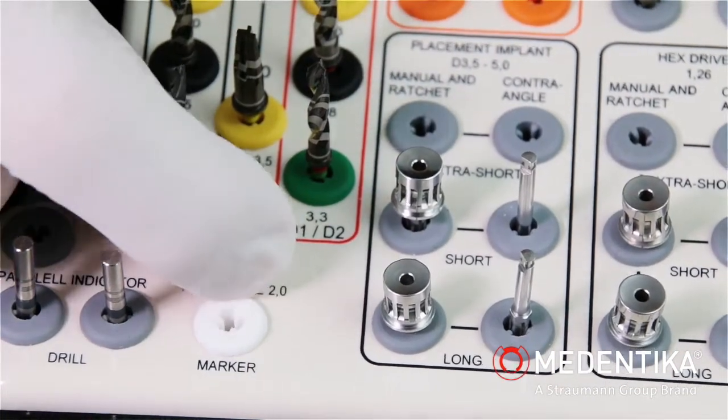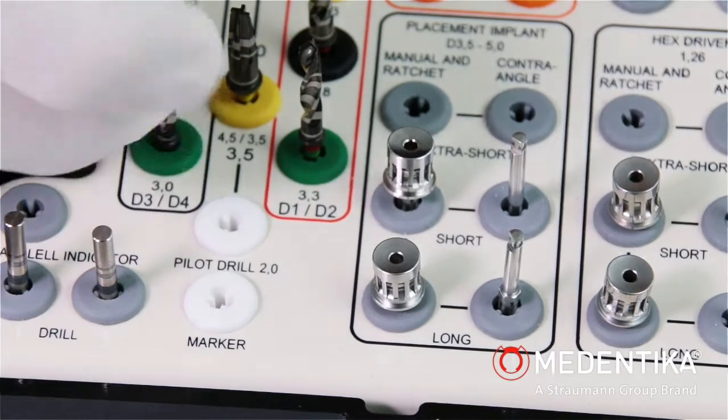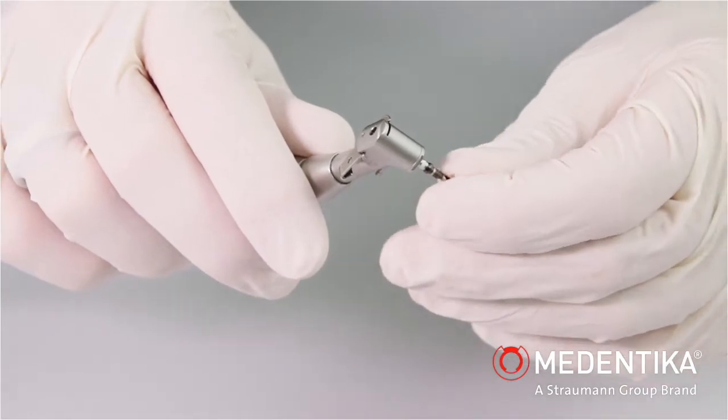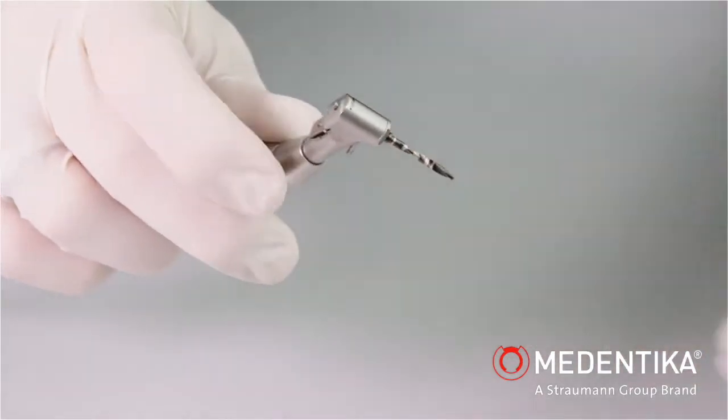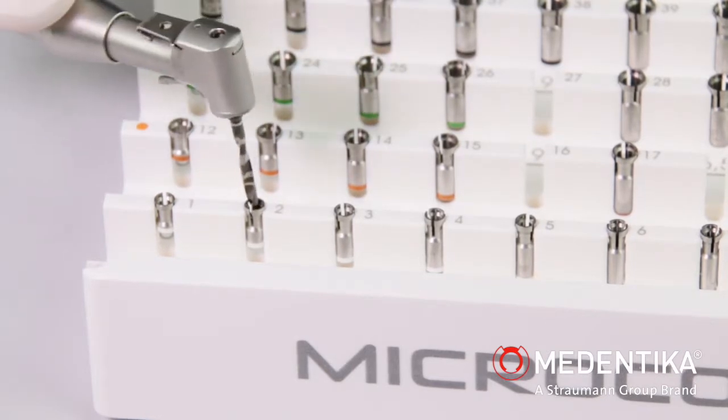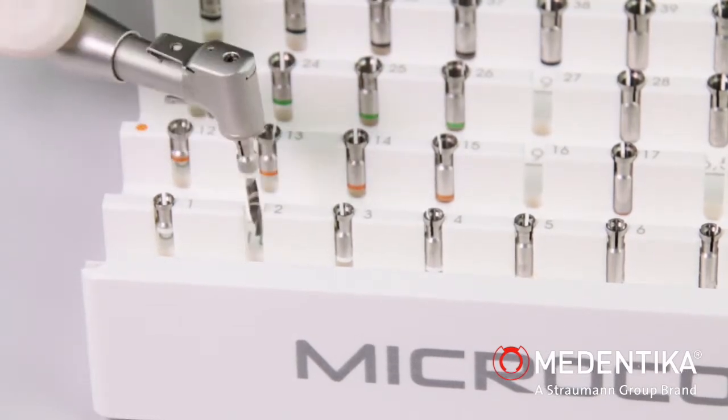The pilot drill 2.0 mm white ring is used for initial drilling. The sagittal direction of the implant axis must be observed. A maximum motor speed of 800 revolutions per minute should not be exceeded — this applies for all further drilling sequences.